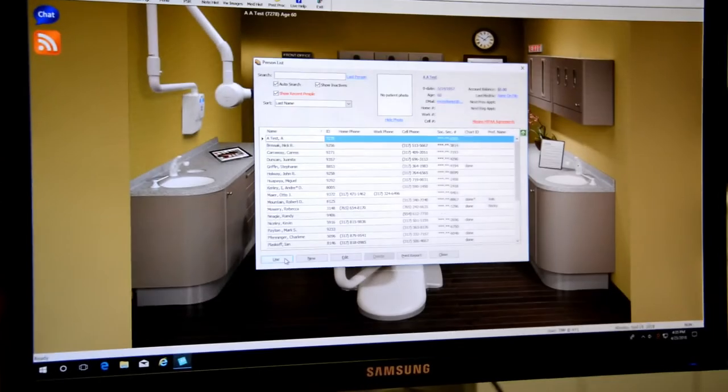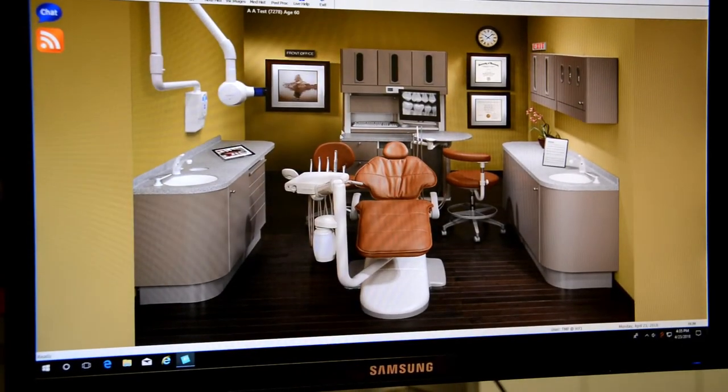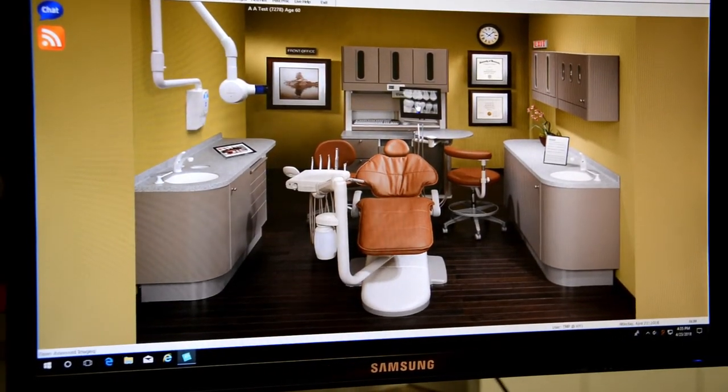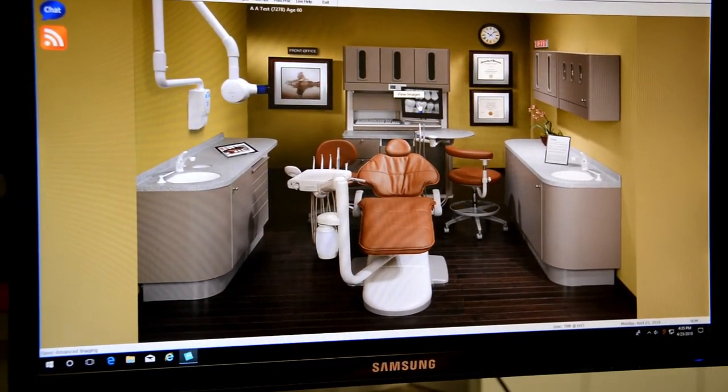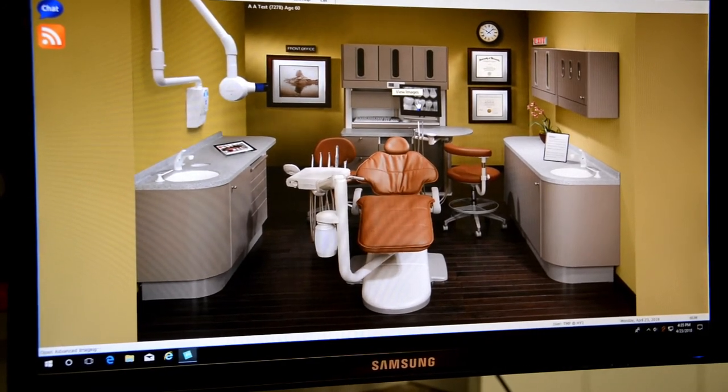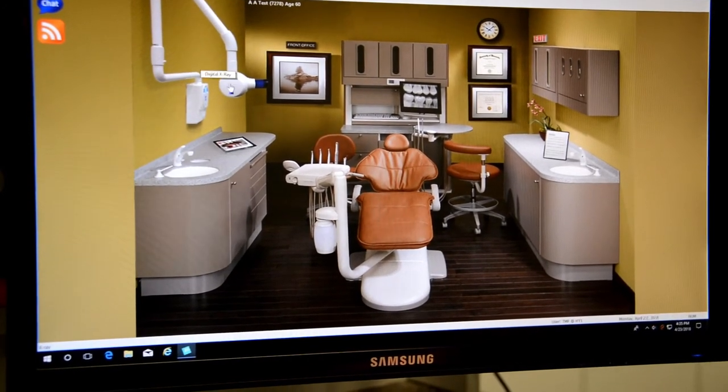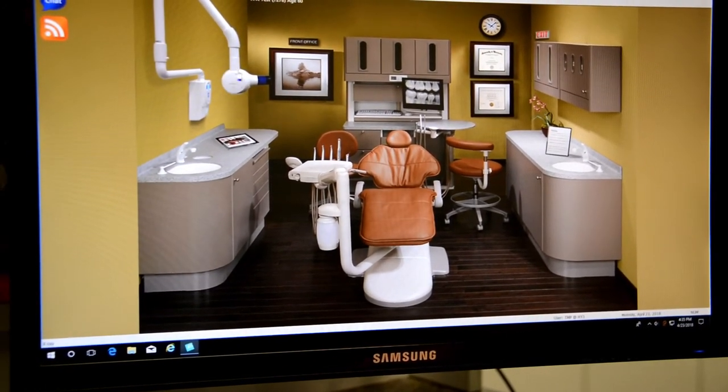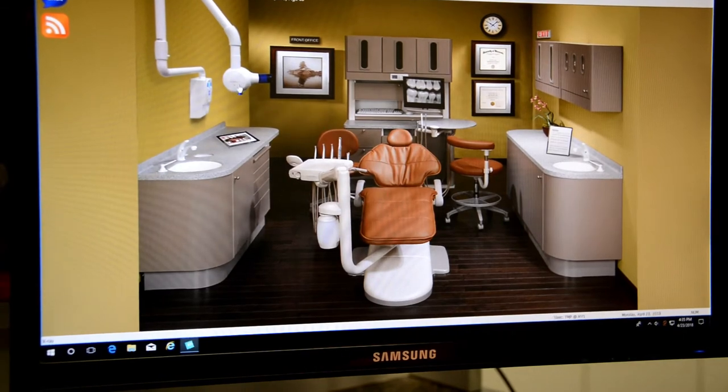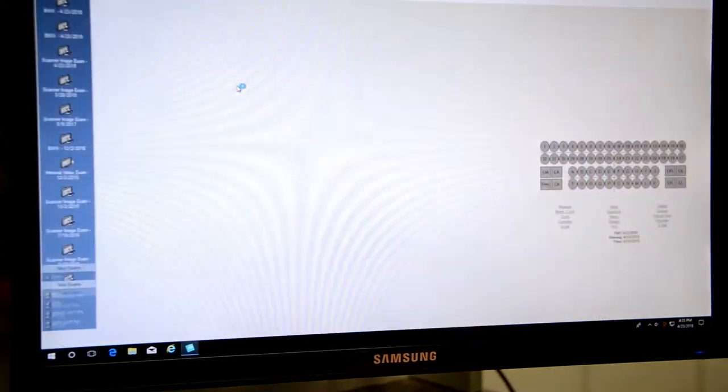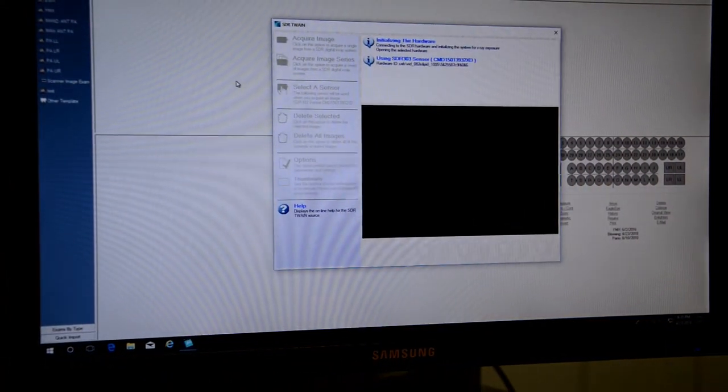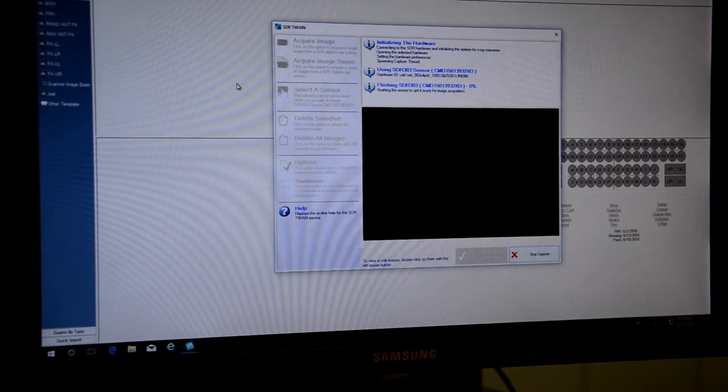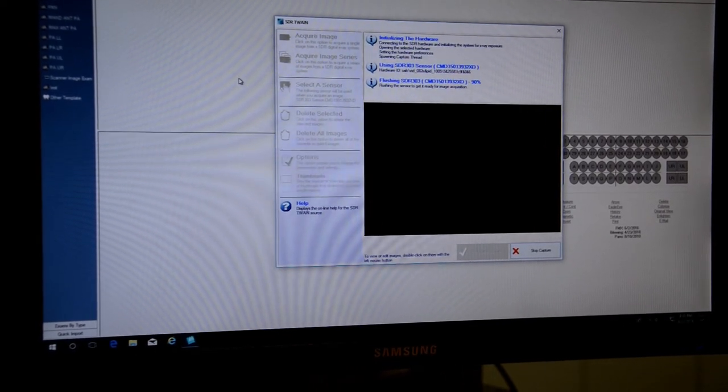First thing I'm going to do is select the patient. I'm going to just select a test patient. From there we will click on the view images so we can see the images that were taken. You can also click our digital x-ray here off to the left as well. That's going to bring up and automatically initialize the sensor for us.